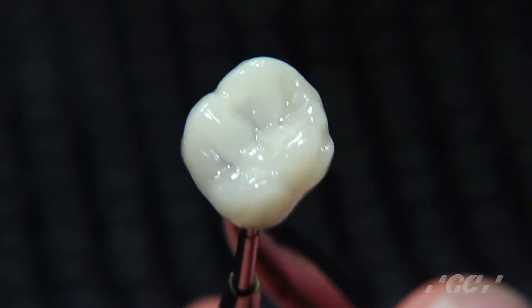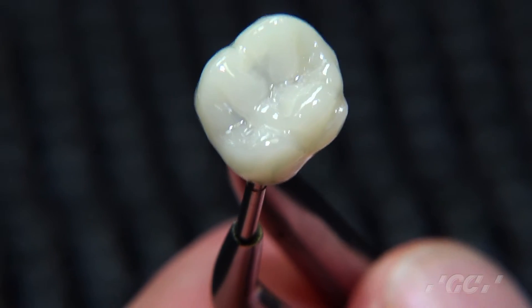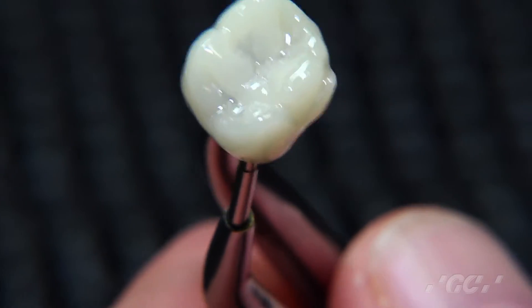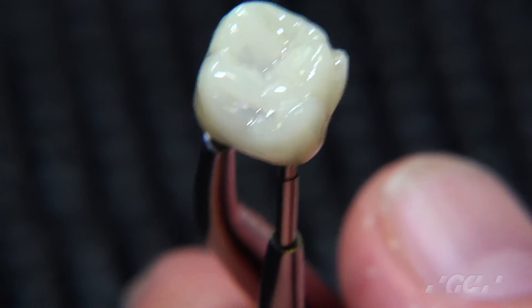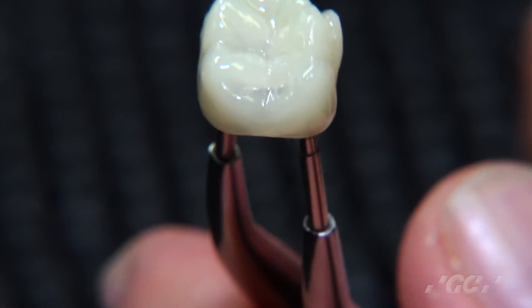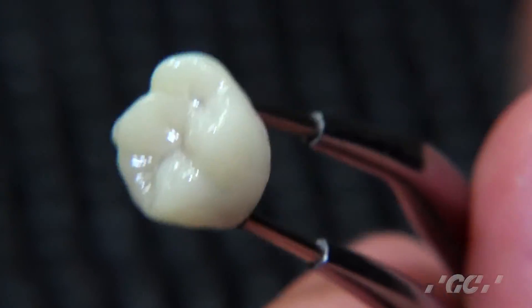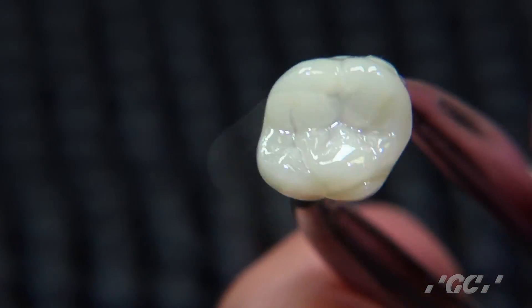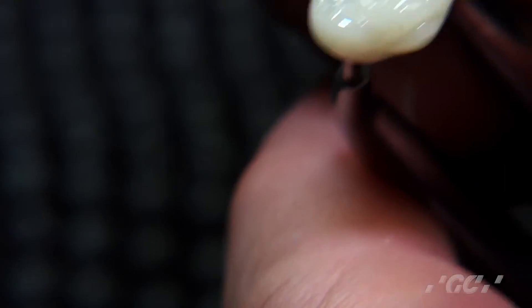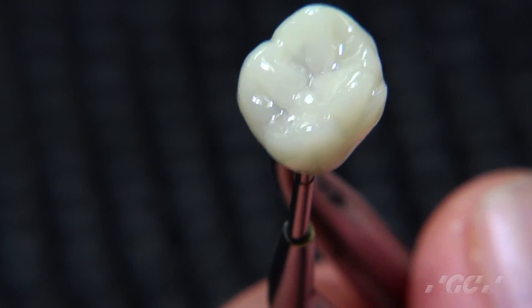Some may ask: what happens if the glaze wears off? Remember, this can be touched up with the OptiGlaze in the mouth. Also, Cerismart has the unique ability to self-polish itself. Because the OptiGlaze and OptiGlaze color both use a special nano-ceramic network and structure, they share very similar high physical properties. Additionally, the material doesn't rub off — it doesn't have an air inhibition layer, so it keeps that shine without a sticky layer on the surface.